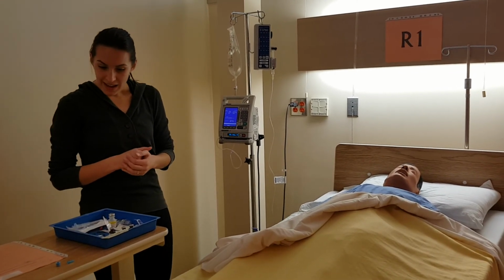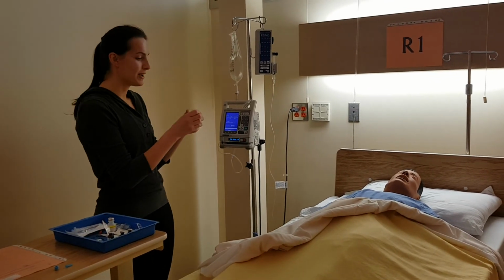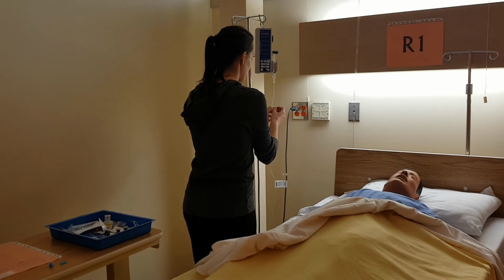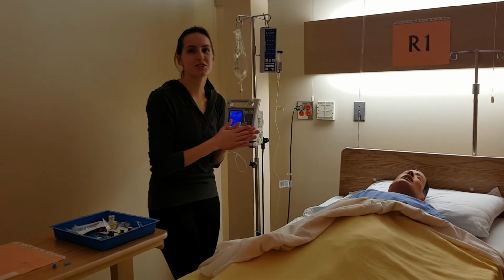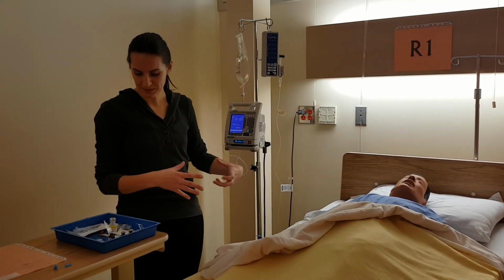And I have my label here for my tubing. So it has my initials, date, and time. So I'm going to label my tubing. Okay guys, we have about 14 minutes left. This ensures that any nurse just knows that this is when this tubing was hung.